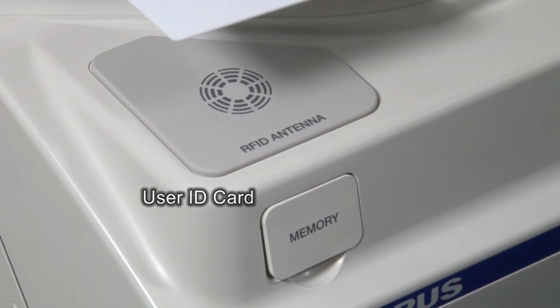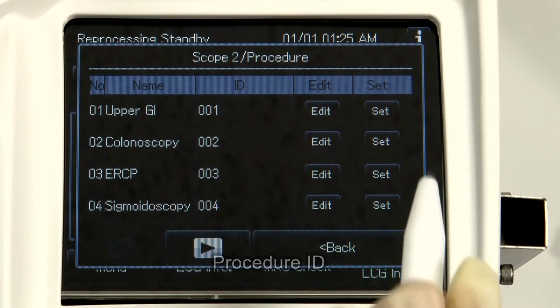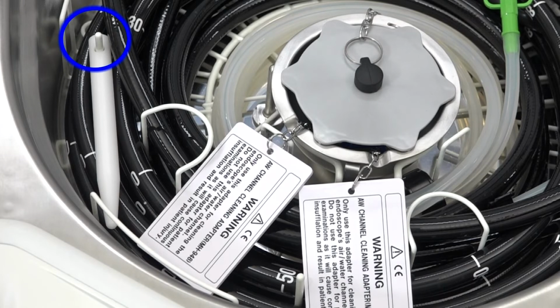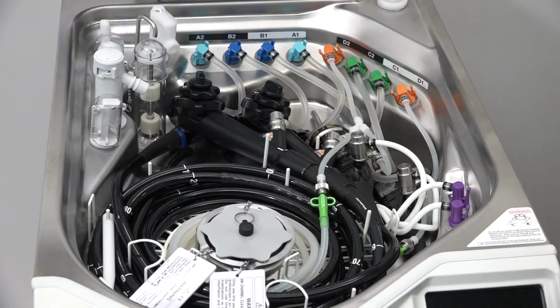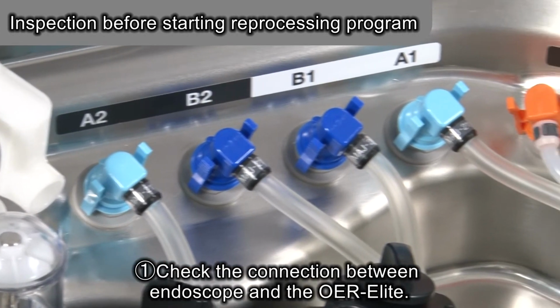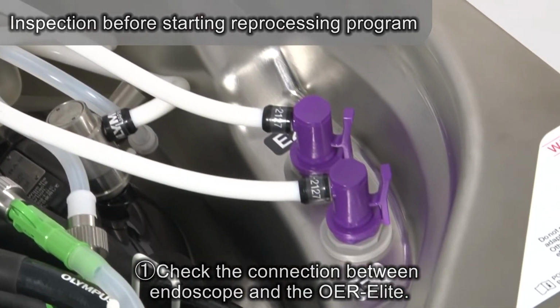Input user ID, physician ID, procedure ID. Set the stylus pen by fitting the hole around the pin of the retaining rack. Check the connection between the endoscopes and the OER ELITE before starting reprocessing programs. Also, check that the connecting tubes and leak test air tube are not kinked.